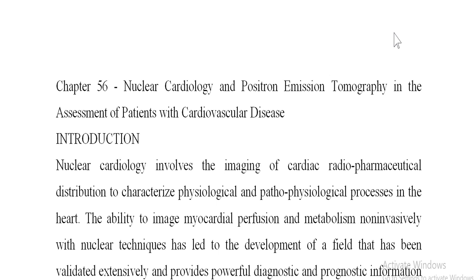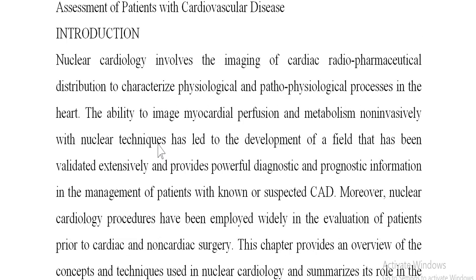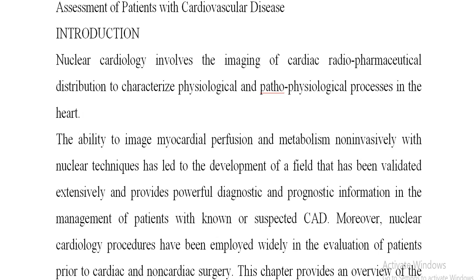and positron emission tomography in the assessment of patients with cardiovascular disease. Introduction. Nuclear cardiology involves the imaging of cardiac radiopharmaceutical distribution to characterize physiological and pathophysiological processes in the heart. The ability to image myocardial perfusion and metabolism non-invasively with nuclear techniques has led to the development of a field that has been validated extensively and provides powerful diagnostic and prognostic information in the management of patients with known or suspected CAD.